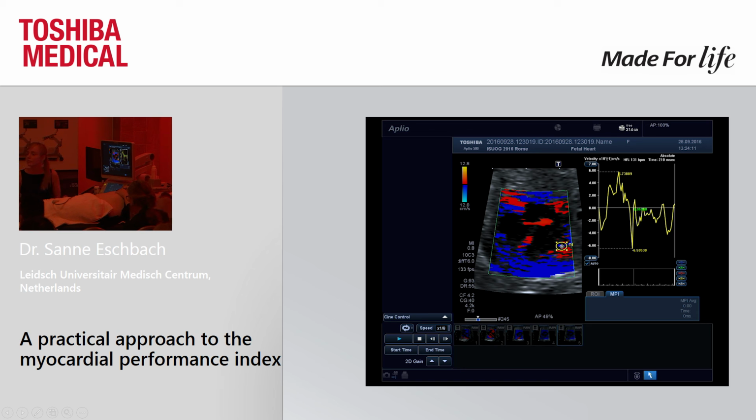One comment about the MPI value. Of course, you did it in a different order, so the values are a little bit strange, but you can use the default order to calculate the isovolumetric contraction and relaxation time, and then you have values comparable to the MPI values that you would expect, a little bit shorter because we measure different events. But that's the message of this measurement actually.